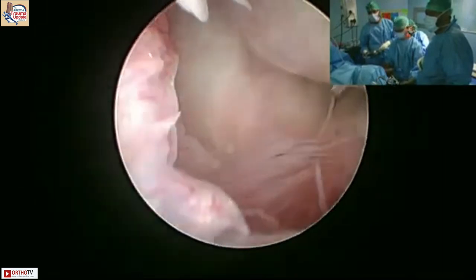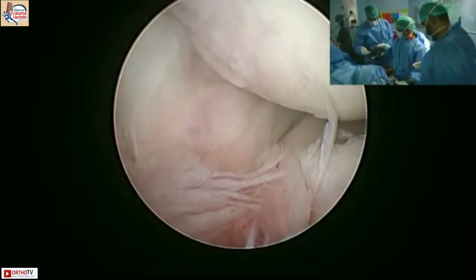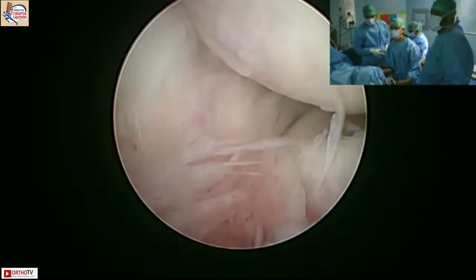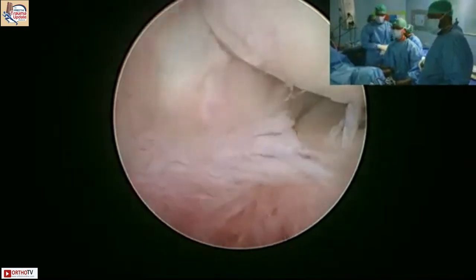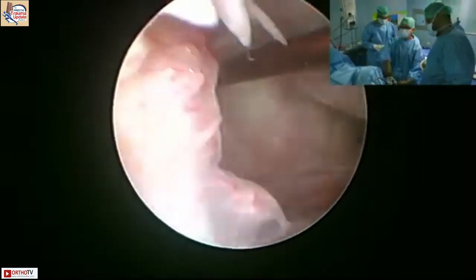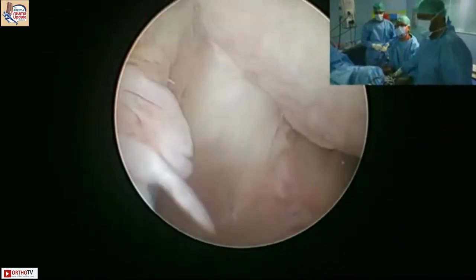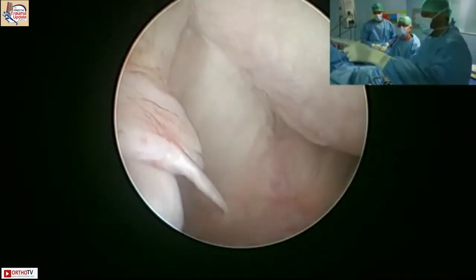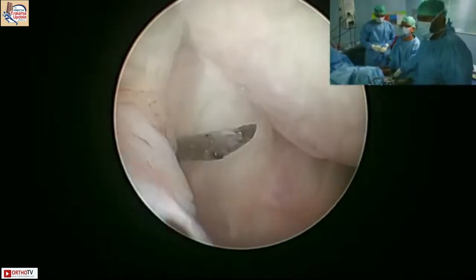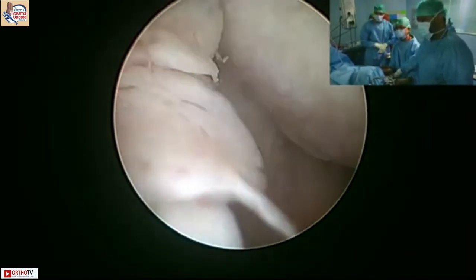Where am I? Needle is in. Can I have a spinal needle, please? Because you also want a working space. Okay, so I am probably a little anterior and a little inferior. I want to be a little higher than that. It's not bad. So you see that fold of the synovium? Yes, we can see that. So there's no cartilage there, you can see? It's bare. So I can be a little more up. And a little more, yeah, there.